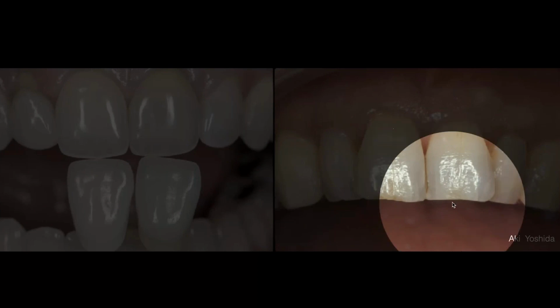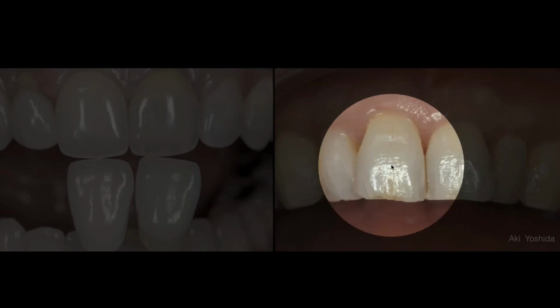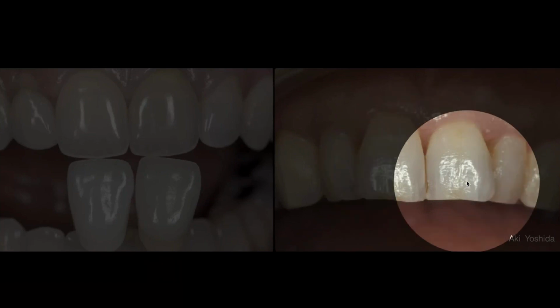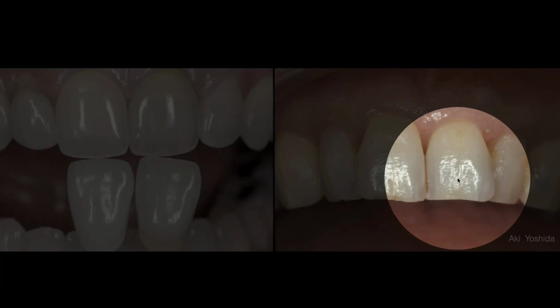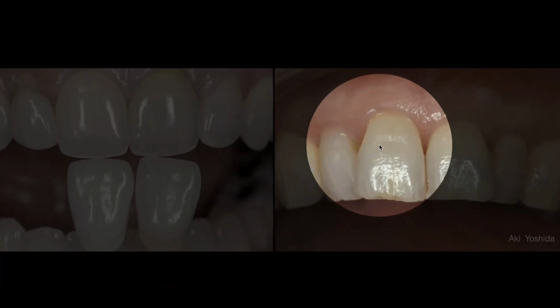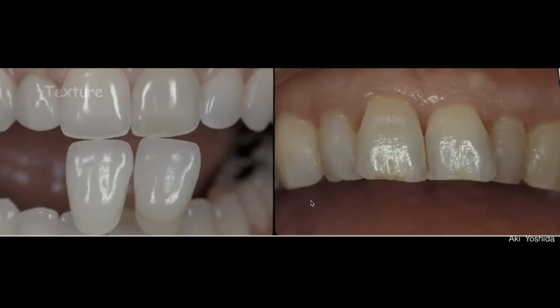Except for the fact there's a lot on both teeth. There's a lot of things happening there, and those lot of things make it easier for us. We don't have to make it perfect. We just have to make that bunch of light want to gather in the center of the tooth and put a lot of bumps and ridges and little index cuts in there to make this flow a little bit. So much easier to make that one work.